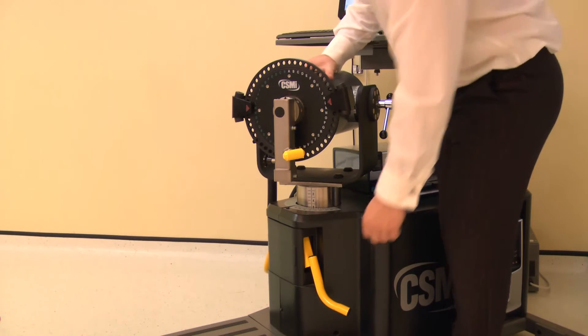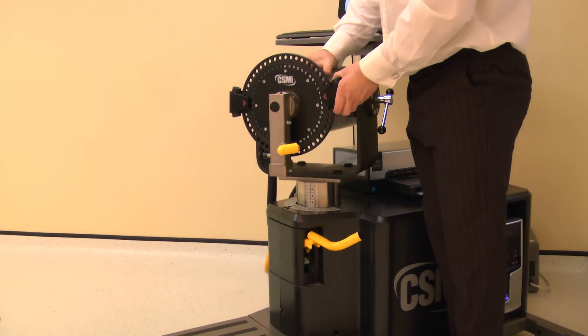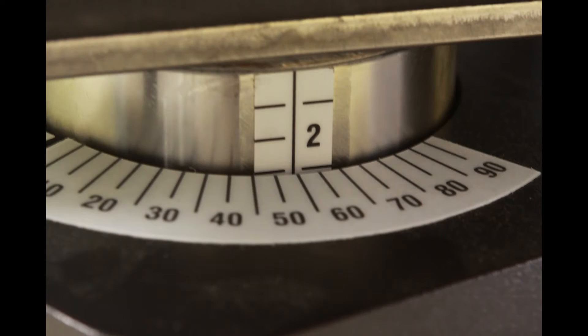The dynamometer height and rotation are adjusted together. Lift the locking handle to release. Rotate the dynamometer to 55 degrees on the black scale. Then adjust the height to 3. Ensure both locking handles are pushed down to secure.